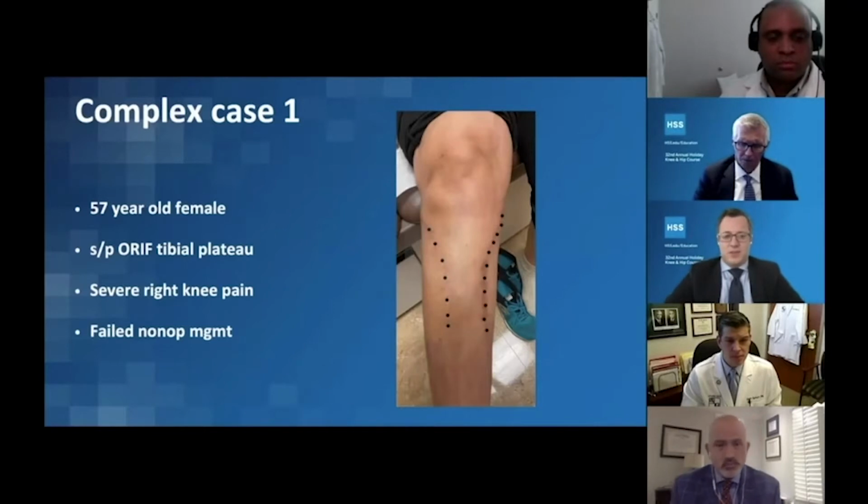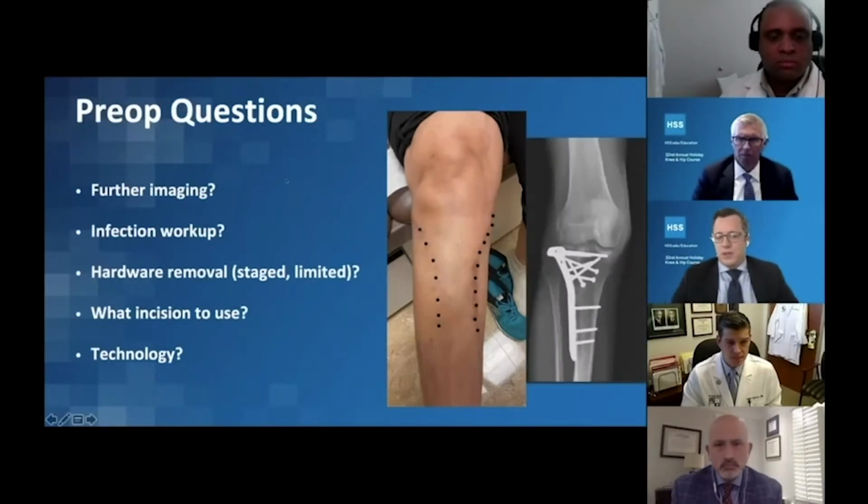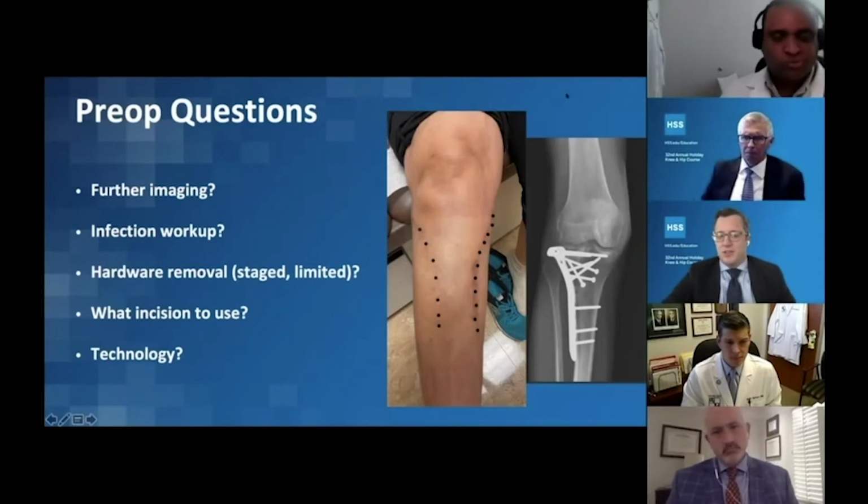So now you can see clearly we've got a couple challenges here. Not only what to do with the bone, but also the skin management. So I'm going to go through step by step, and we'll get some of the panel's thoughts on what we do here. Bolo, any further imaging you need on this patient? You've got the x-rays. Did that tell you enough? Or are you going to get anything else?